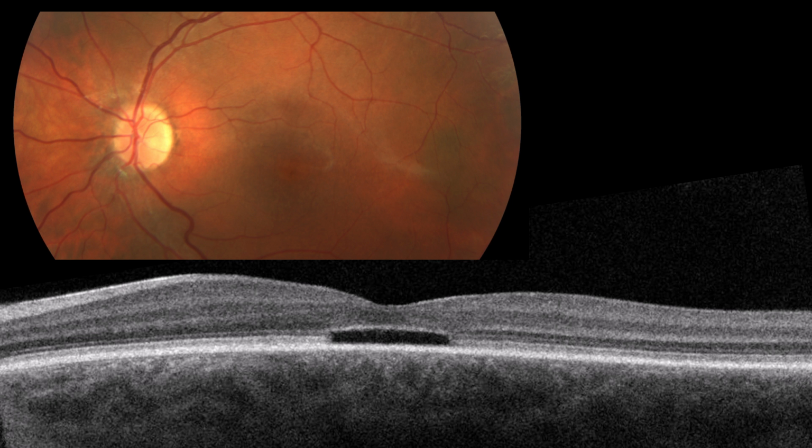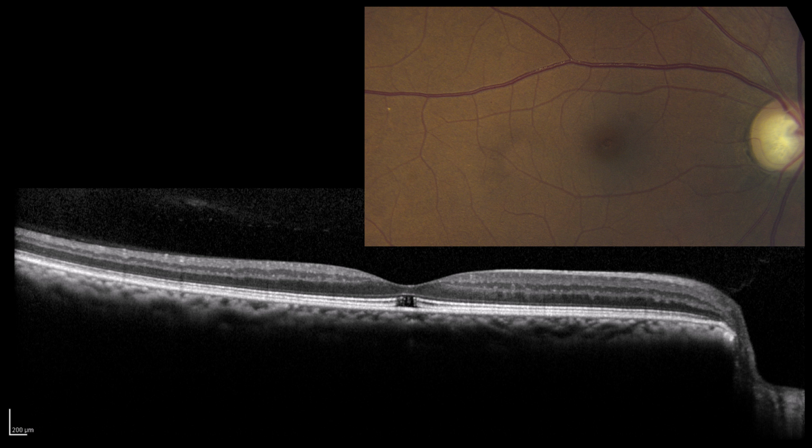This is a patient I saw about 2 months ago that came in saying that he was told he had a progressive cone dystrophy, but he also had nystagmus. So he probably got the wrong diagnosis from somebody else, but it looks like he's got achromatopsia. He's 20/50, getting along fine, 20 years old. This is a patient that liked to stare at the sun when he's out in the field. His other eye looks just the same, so he's got a solar retinopathy. He also had some other interesting features I'll have to share in another lecture.